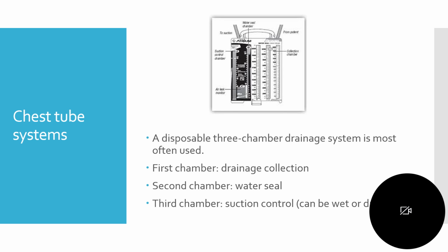Okay, and so you will see in the hospital that the nurses, the way they keep I&O, because this counts as an output, is that when they come on shift, they mark where the level is, and then when they leave, they mark where the drainage is at that time, and then they count how many milliliters of drainage for that shift.